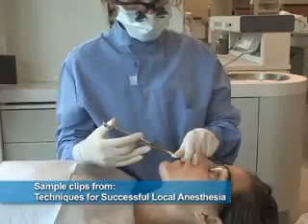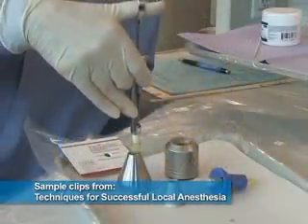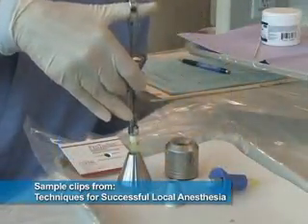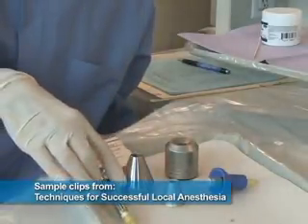Finally, withdraw the needle slowly from the tissue and make the needle safe using an accepted recapping technique. A variety of commercial needle guards are available for healthcare professionals.